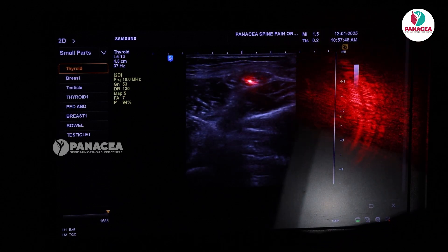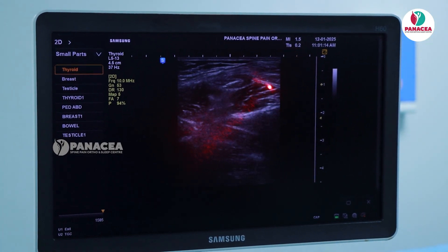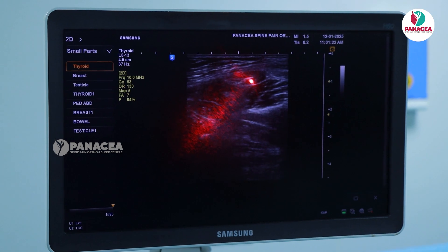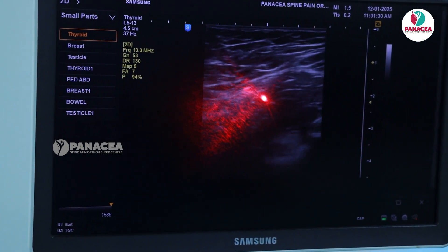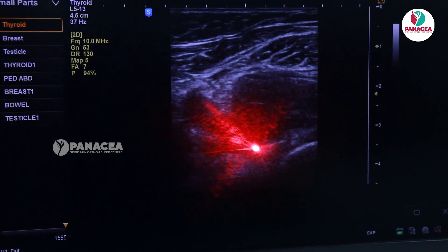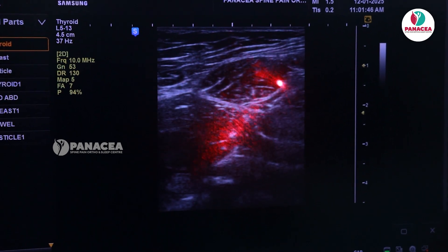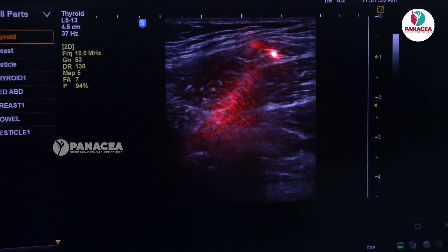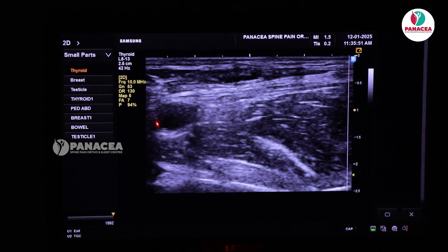We are now injecting the drug. Dr. Deepa is performing the LFCN block. Dr. Ankit, the neurologist, will explain the below-inguinal-ligament sonoanatomy. This is the femoral artery, and just lateral to it is the femoral nerve. This structure is the iliacus muscle; lateral to that is the sartorius muscle, with the groove dividing the iliacus and sartorius.